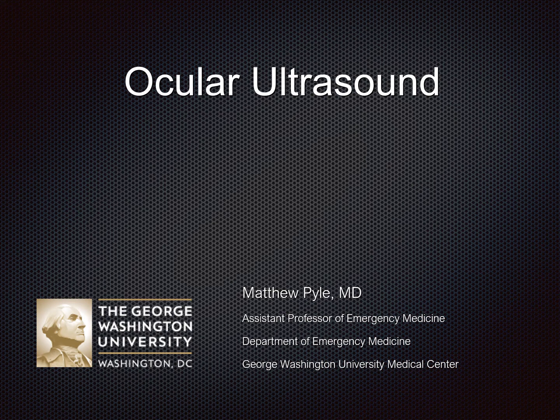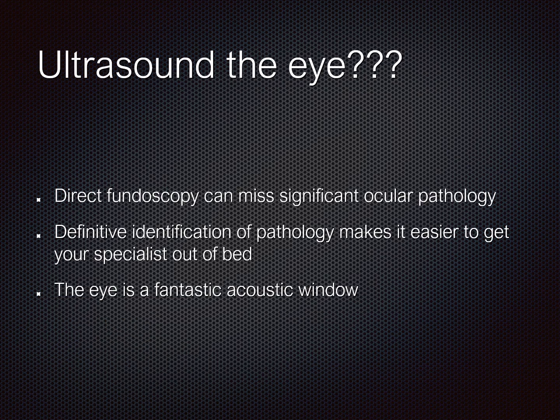All right, my name is Matt Pyle, and today we're going to be talking about ocular ultrasound. So why ultrasound the eye?